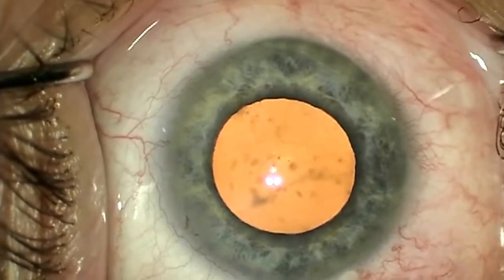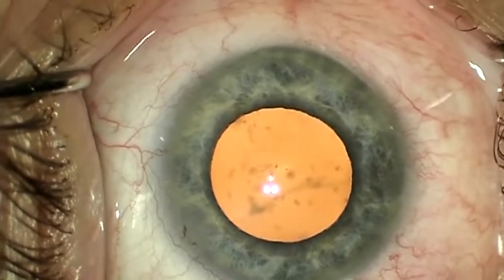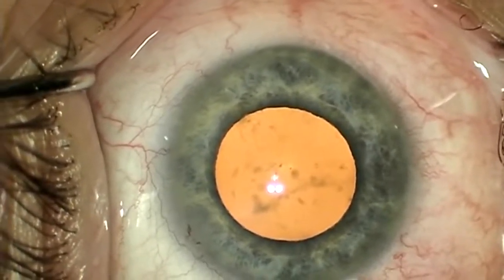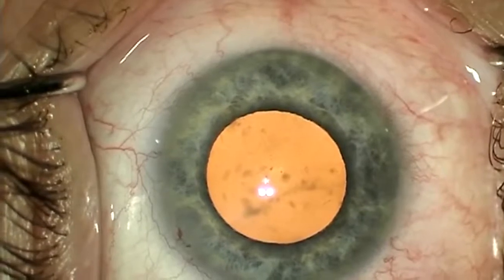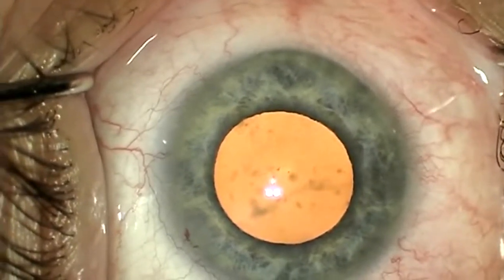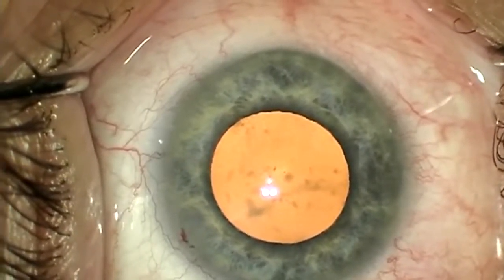For me to use an expansion device it's got to be quick, safe, and easy to implant and explant. The X-band iris speculum fits these criteria perfectly in my opinion. It's a very thin metallic low-profile iris expansion device that's easily, safely, and quickly implanted, provides a wide field of view, and is easily and safely explanted with a minimum of iris trauma and intraocular gymnastics. I have no financial interest in the device or the companies that produce or distribute it.